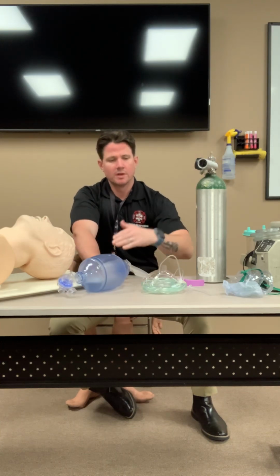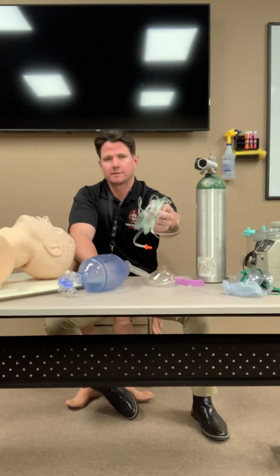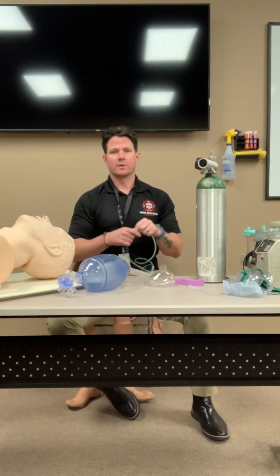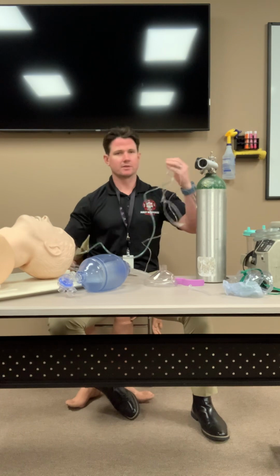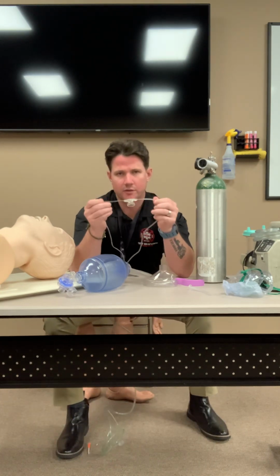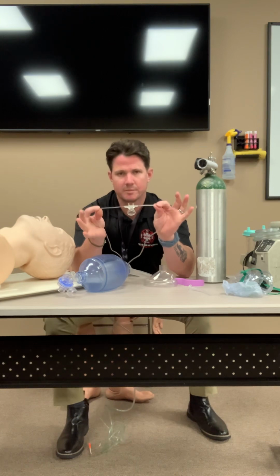Now I want you to apply a nasal cannula to your patient, all right? Again, you need to pick the appropriate airway device, all right? This is my nasal cannula, okay? Again, if it's not this exact one, look for the two-pronged nose piece. It's kind of hard to miss, all right? These two prongs go in the nose, all right?